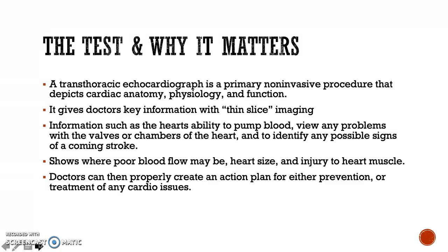A transthoracic echocardiograph is a primary non-invasive procedure that depicts cardiac anatomy, physiology, and function. This gives doctors key information about the heart using thin slice imaging, such as the heart's ability to pump blood. It views any problems with valves or chambers of the heart and can identify any possible signs of a coming stroke and/or heart attack.